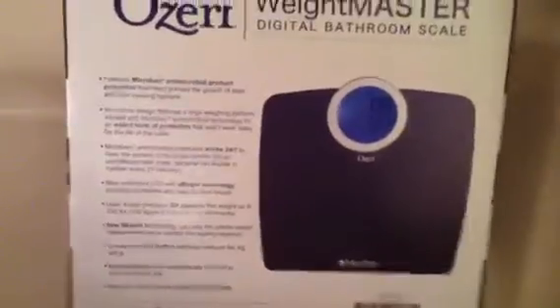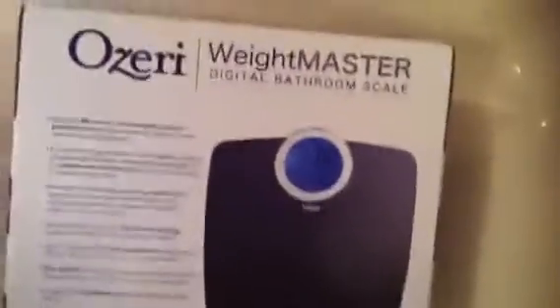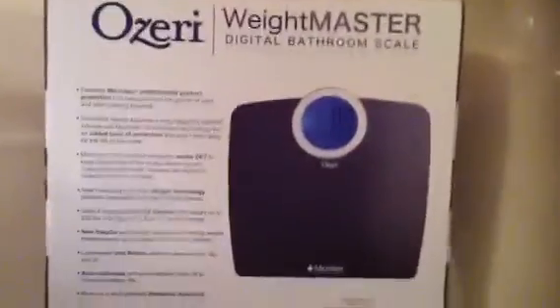The Ozeri Scale is made with microband anti-microbial protection, which helps prevent the growth of stain and odor causing bacteria. It has an oversized LCD with X-Bright technology, and runs on three AA batteries, which are included.